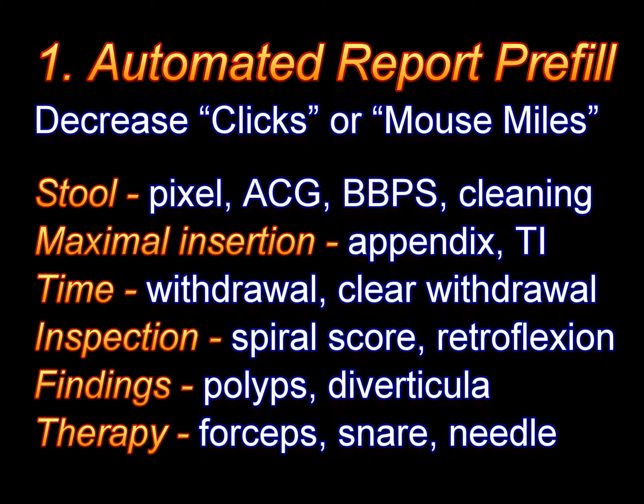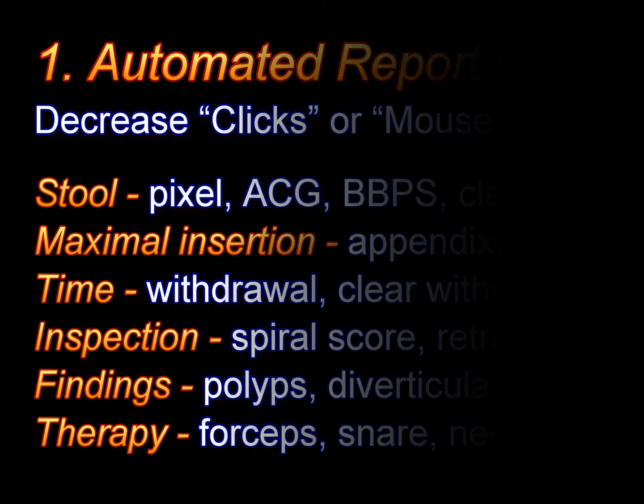Maximum insertion can be estimated from recognition of the appendix or terminal ileum. Similarly, there are measures for time points, inspection activity, findings, and therapy. Many of these could be used to prefill much of a regular endoscopy report. Under best of circumstances, the endoscopist confirms the entries with very few clicks.